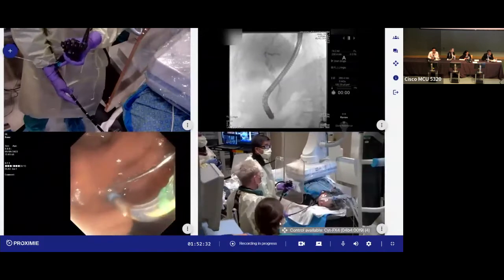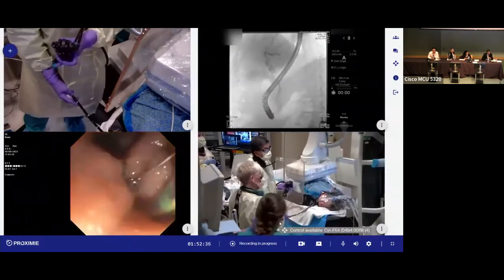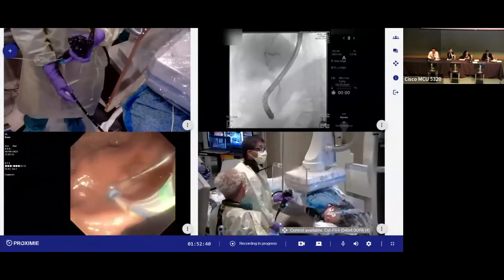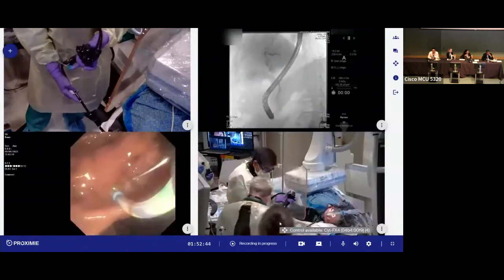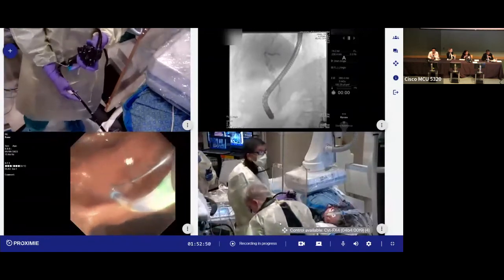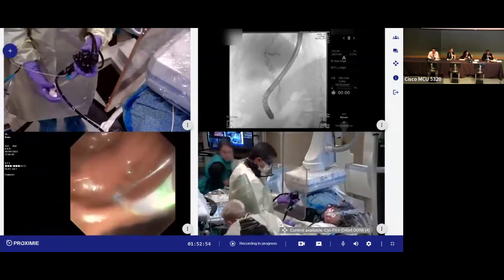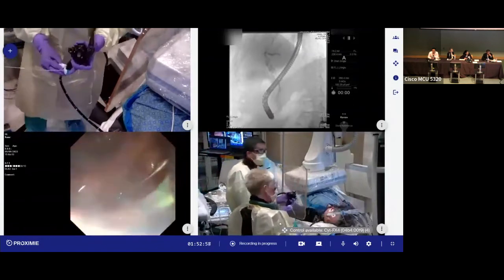All right, let's go. We can go here. I think it's more an image. It's just a blurry image. Does that image look blurry to you? Absolutely, yes. Are you connected? You are. The grounding pad. Okay, we're going to double check the grounding pad. It's green now.